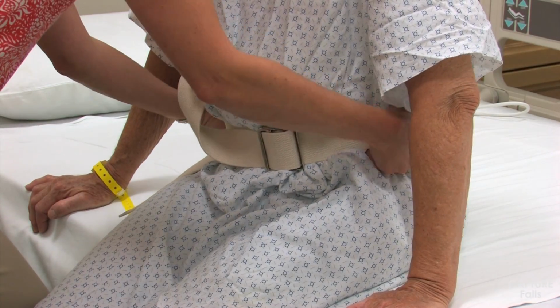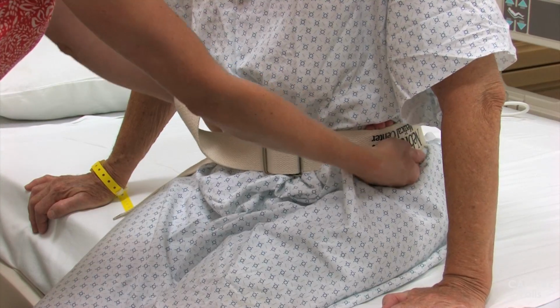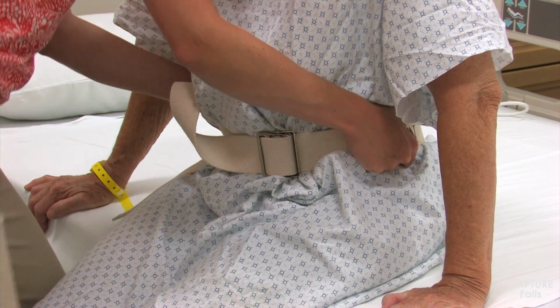When holding onto the gait belt, grasp it so that your fingers are coming up under the bottom edge of the belt. Don't hold it from the top edge. If the patient begins to fall, you will likely lose your grip if your hand is positioned this way.